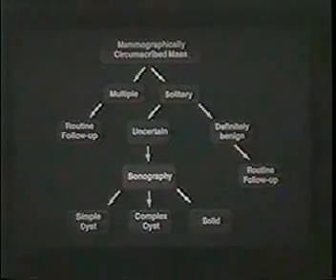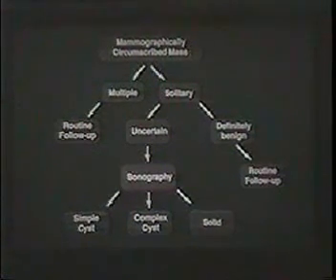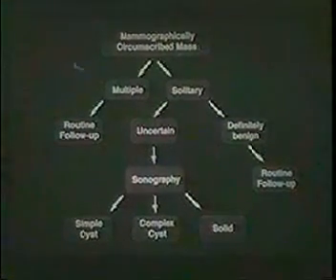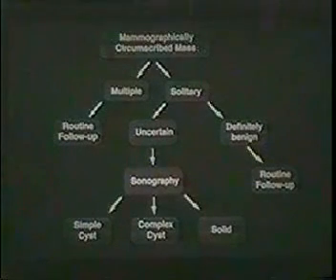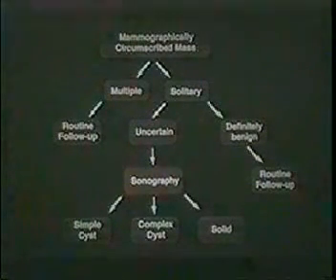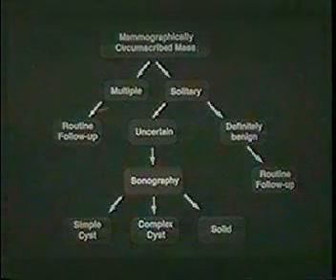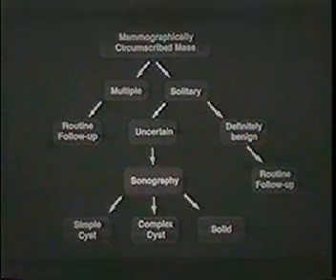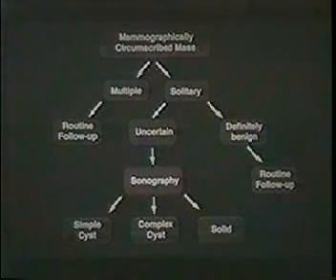In terms of the overall management of the woman, when we find a mammographically circumscribed mass in the breast, that's when sonography is most important in the mammographic workup as an adjunct. If circumscribed masses are multiple, we do routine follow-up. We do not go to sonography because multiple circumscribed masses are benign.